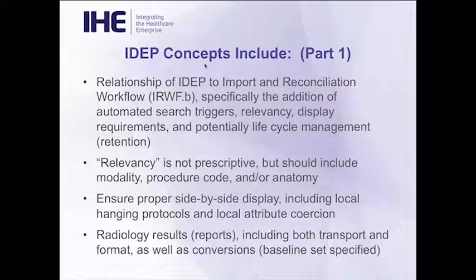We will talk about in the concept section a very interesting subject, radiology reports. It includes different types of transport, being, for example, an HL7 version 2 ORU. It could be a DICOM secondary capture. It could be a DICOM SR. It could be a DICOM Part 20 CDA, as well as the format conversion, because there's multiple variables when it comes to reports, because there is no standardized interface to this quite the same way that there is as DICOM for images. So the radiology reports section will probably end up being half of the profile in the long run, but that's okay. We need to get it worked out.